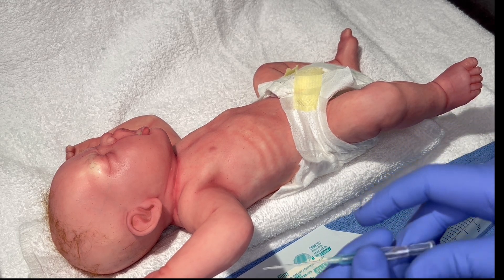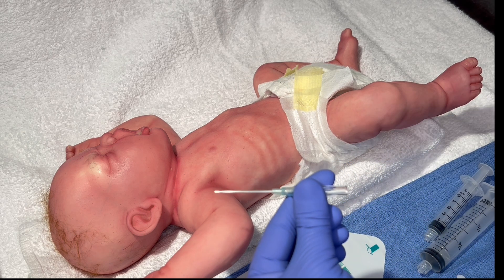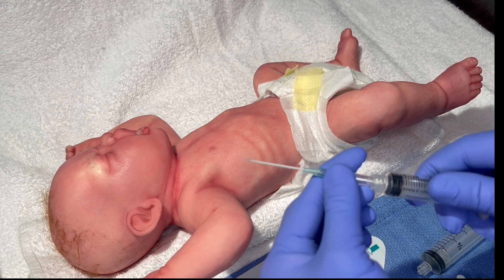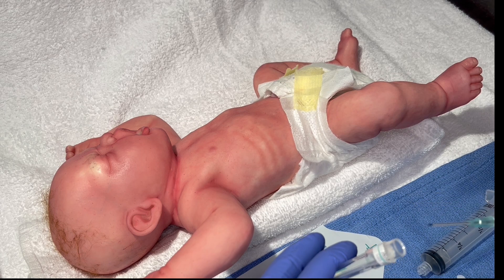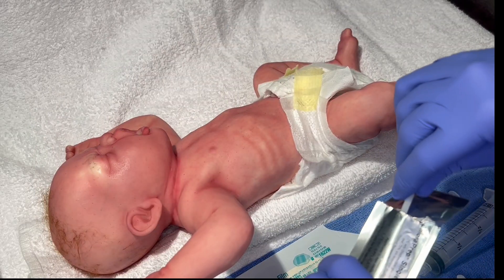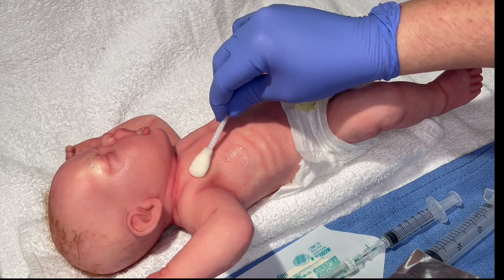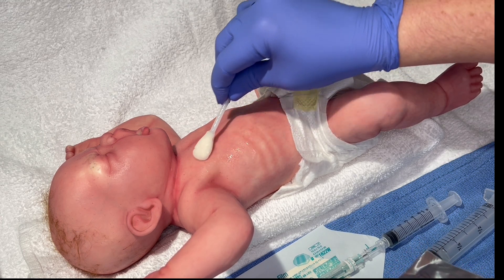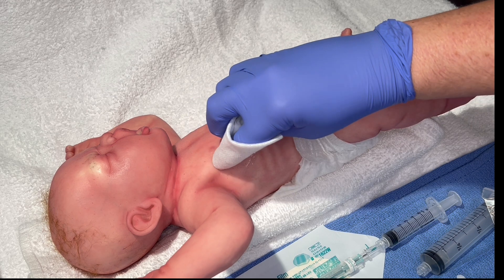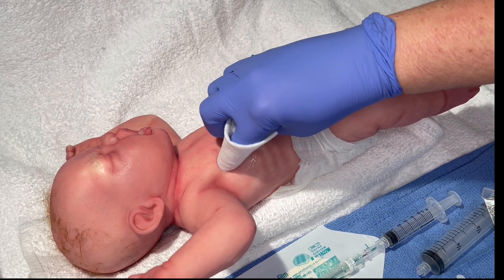Now that the patient is in the correct position with the affected side up, you can prep your IV catheter. If it is non-safety, remove the back end, as seen here, and then place the 5ml syringe to use during placement. You'll now want to cleanse your site in a circular motion using hospital-approved cleanser, such as chloroprep. You'll then take a sterile gauze, as seen here, to cleanse and mark the site.